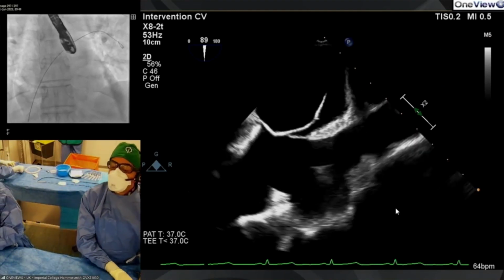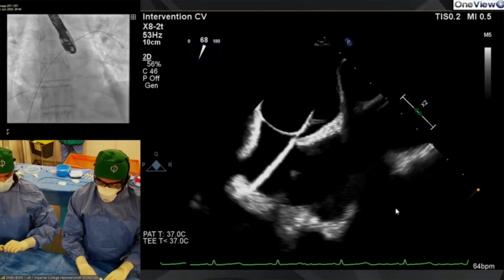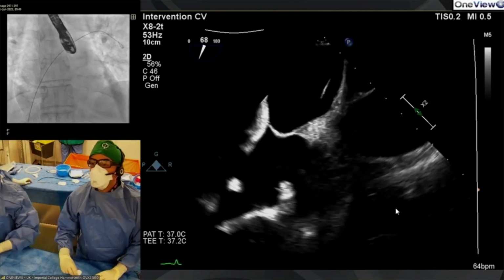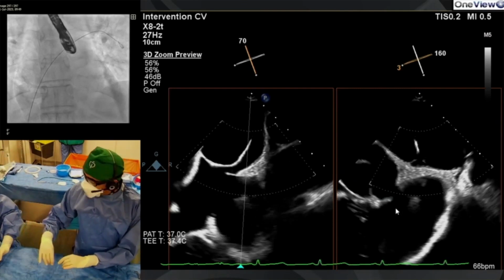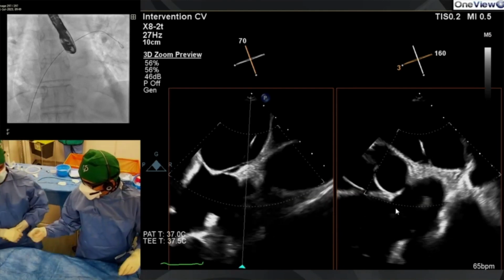Okay, super helpful. Is that a stiff wire, Neil? No, it's just a standard J wire, not stiff. Okay. Comment from Dave Northridge. He couldn't quite get up to the microphone. Never a truer word spoken.